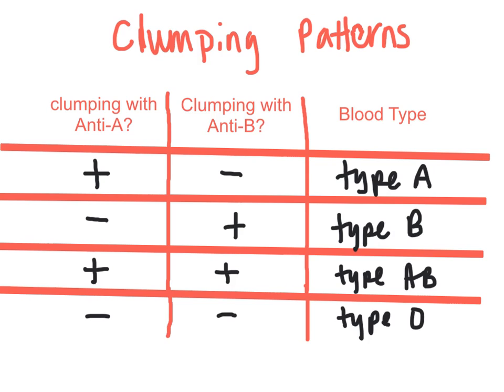For cleanup, take your laminated note card and go ahead and wash it off in the sink. Wipe it down with a paper towel so it's nice and clean, and then take it to a new blood sample and do the process again. You're going to repeat this process for all of our suspects and our crime scene and Anna Garcia.